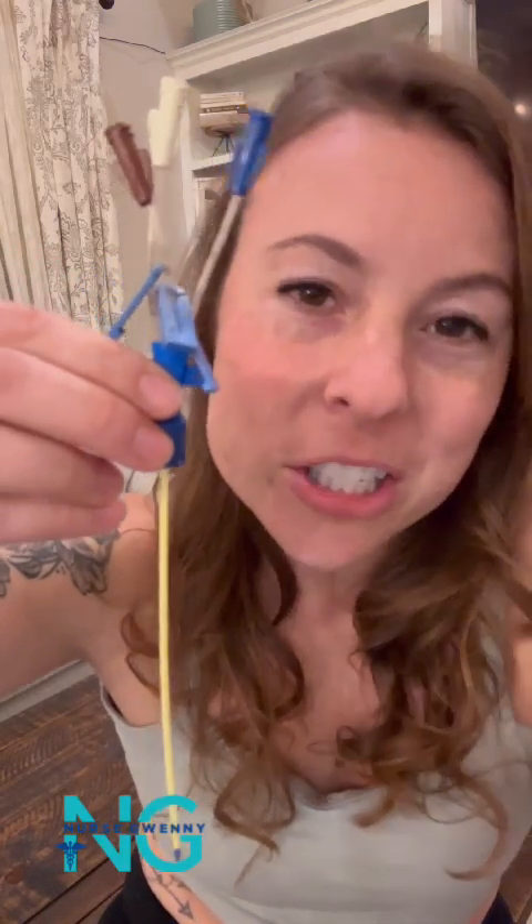Hey guys, it's Nurse Gwenny. Let's talk about central venous catheters, or we just call it a central line or a CVC for short.